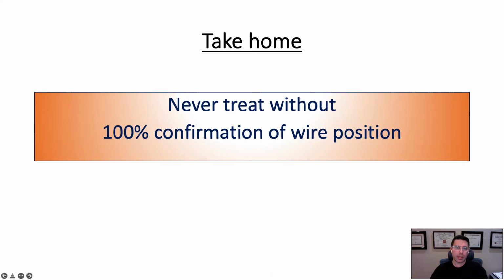The most important teaching point on this topic is never to treat or to advance equipment on top of a wire without 100% confirmation of wire location. You absolutely need to know that, which is a major safety point in these procedures.